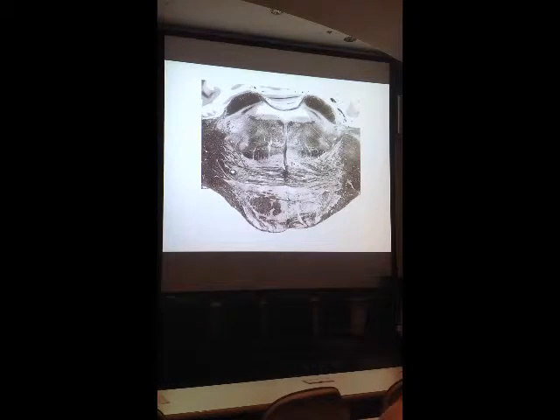Unfortunately, he included a slide where the middle cerebellar peduncle has been trimmed up, right? It's been trimmed, but again, you can see the middle cerebellar peduncle, which goes along the pons. So you should know that this is the fourth ventricle. I could ask you that. And in the lateral wall of the fourth ventricle, this being the upper pons, slide 19 is upper pons.